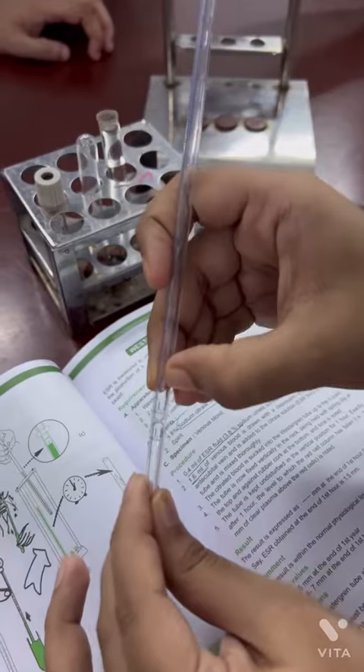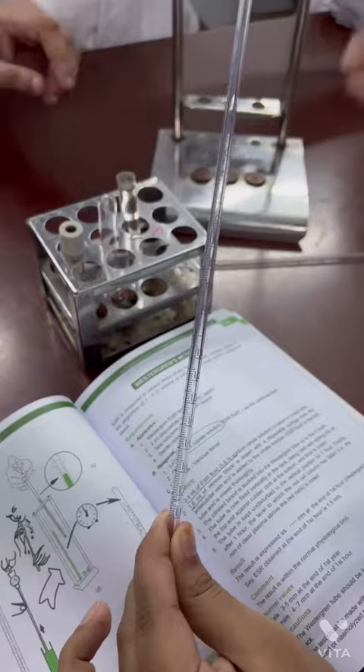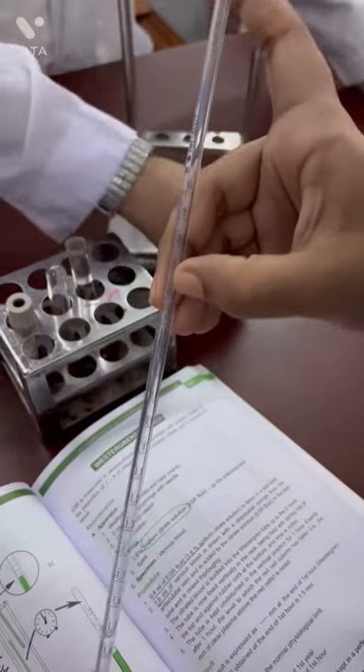The ratio for the test: 0.4 mL of sodium citrate solution is used, and 1.6 mL of blood sample is added to it.